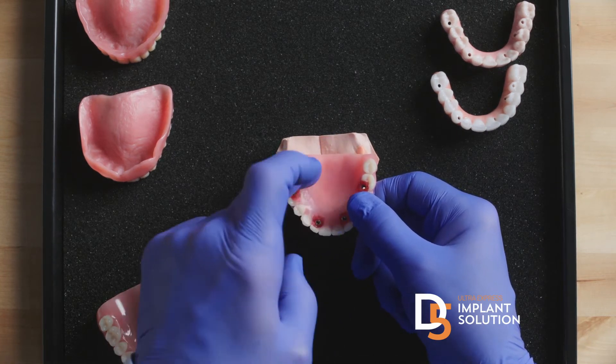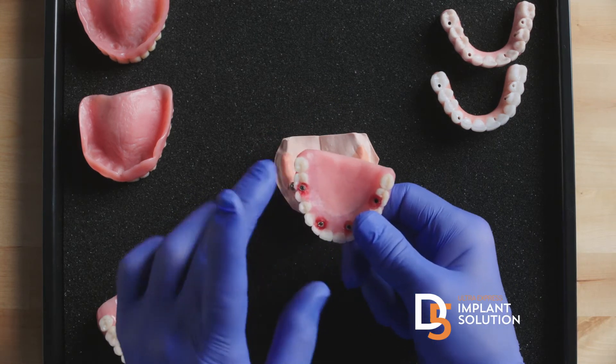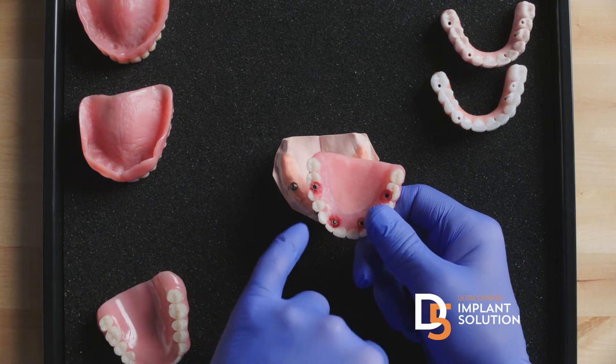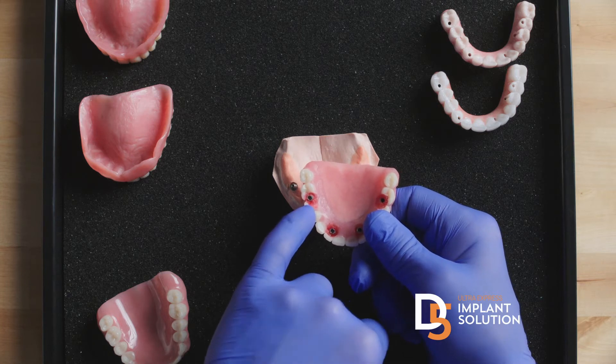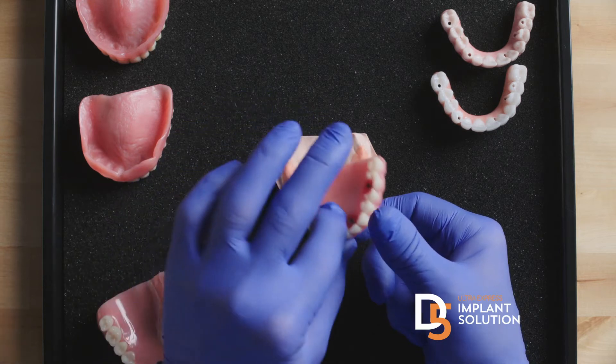You take some of the plastic off the roof of the mouth and try to thin it down, but the problems are numerous. It's usually bulky, it can affect speech. The big problem is the bond between the plastic is weak and it's breaking — and I can say this because I did thousands of these with this old technology over many years.